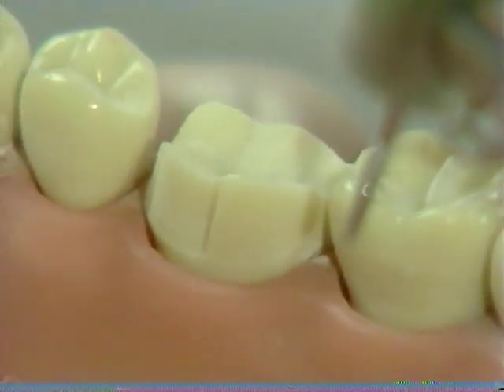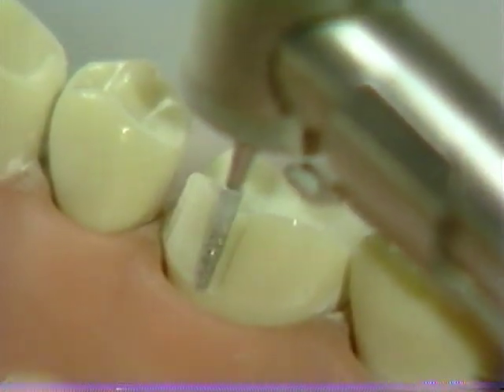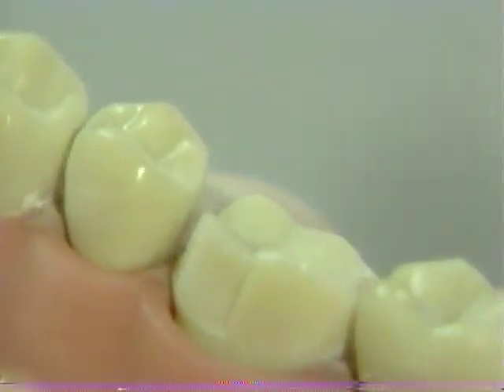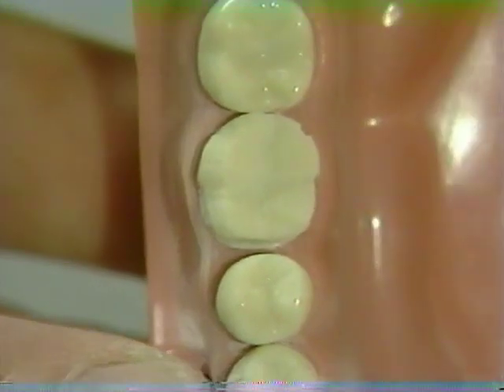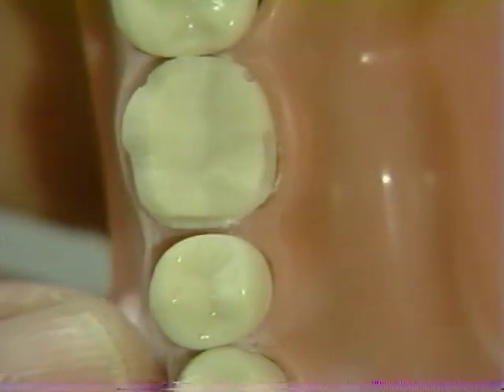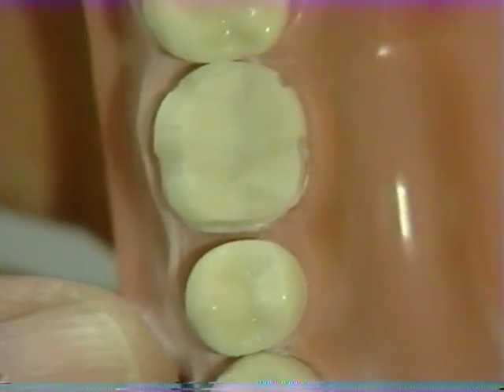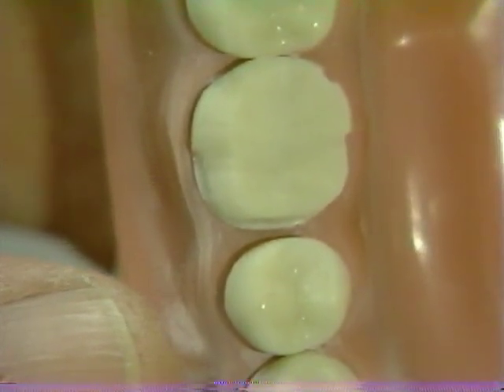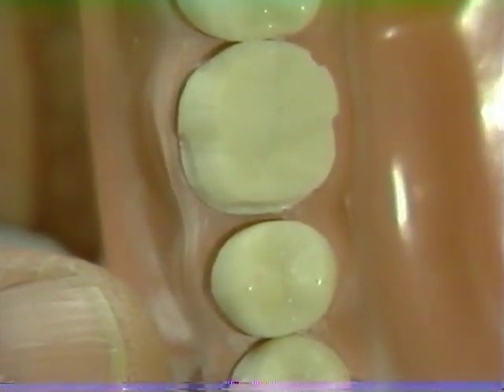Note the continuous and distinct chamfer, approximately half the width of the tip of the diamond. At this stage, an assessment can be made of the adequacy of the axial reduction. The chamfer should be smooth, continuous, and even in width. Note that it is slightly wider in the proximal aspect than in the buccal line angle area — some additional tooth reduction is necessary here.